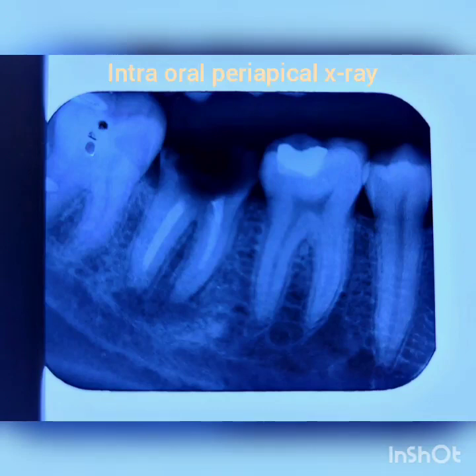This is intraoral x-ray, that is intraoral periapical x-ray showing mandibular posterior teeth, second premolar and all three molars with their periapical region, where second molar has crown loss due to caries and roots have incomplete root canal filling with around 3 mm radiolucency with ill-defined margins surrounding the apices. As per the radiographic findings, it could be a chronic periapical abscess or infected radicular cyst due to caries.